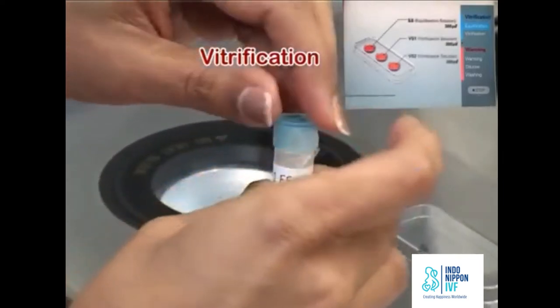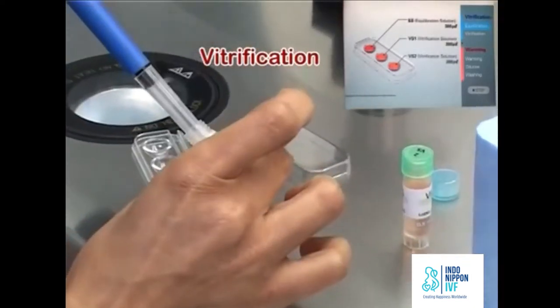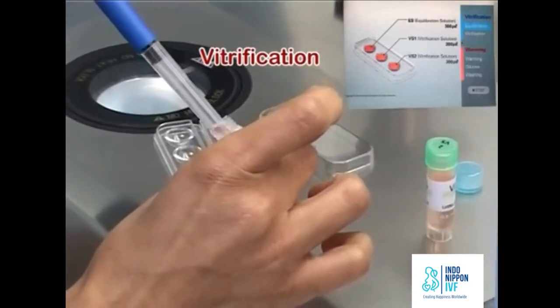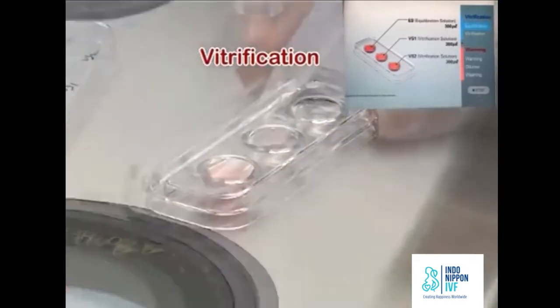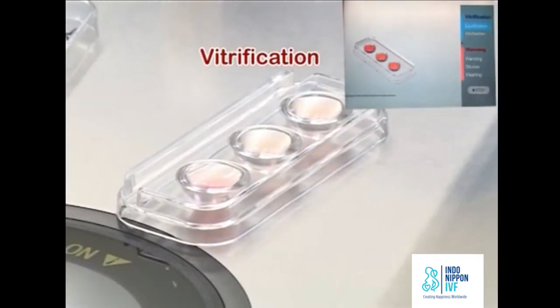Fill the wells of the vitriplate with 300 microliters of ES, VS1 and VS2 respectively. Put the lid back on the vitriplate immediately.